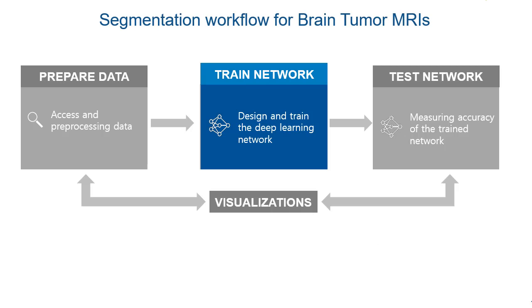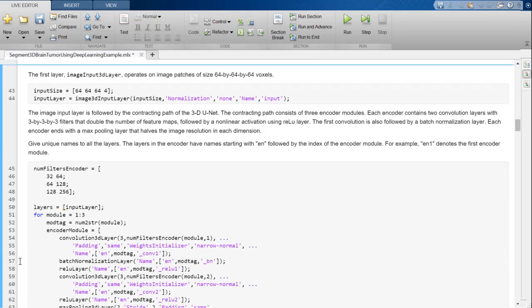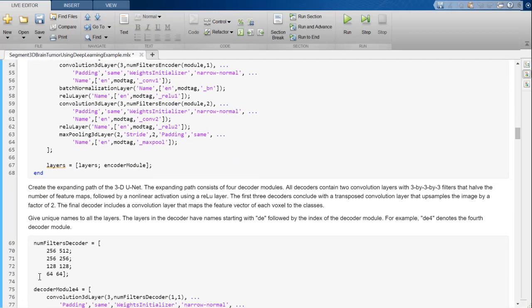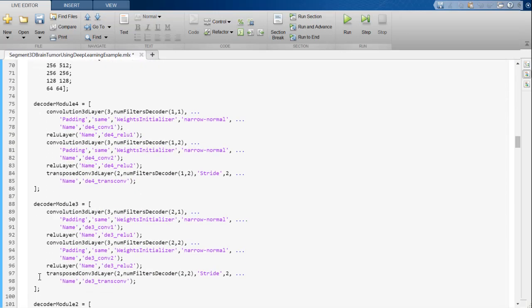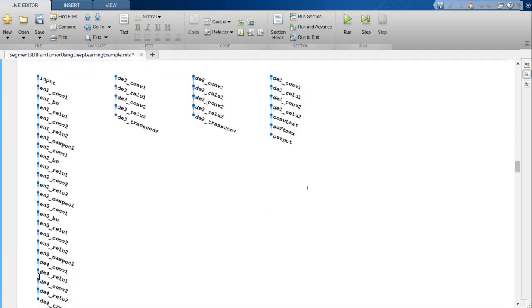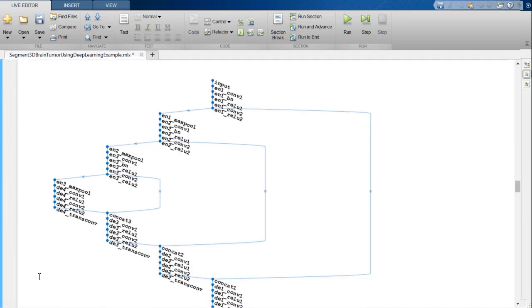Next, we are going to build and train the neural network to perform the brain tumor segmentation. This example uses a 3D U-Net architecture because it requires fewer training images and provides more precise segmentation. We will first create the layers and then concatenate them.